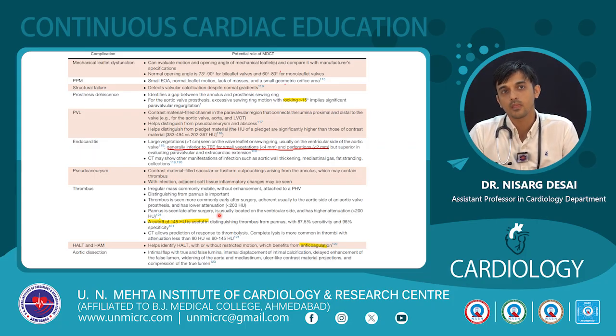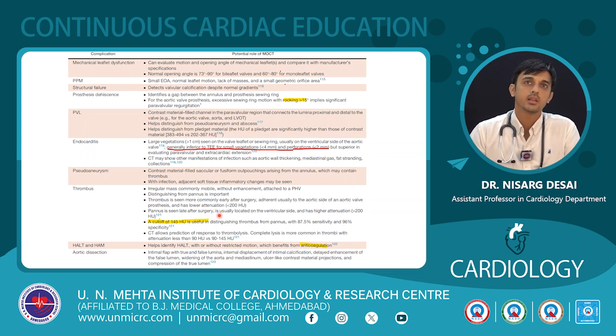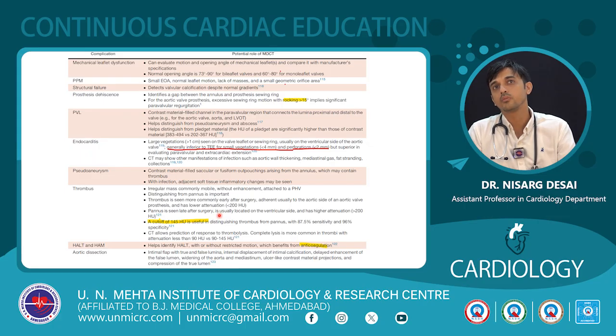HALT and HAM. This is an upcoming thing in bioprosthetic valves. Usually with TAVI valves and degeneration, if there is only thickening of the valves and no obstruction, we call it HALT, and if there is restricted motion as well, we call it HAM. When we are suspecting HALT and HAM, there is a role of multi-detector cardiac CT, MDCT, and the treatment of choice is anticoagulation.